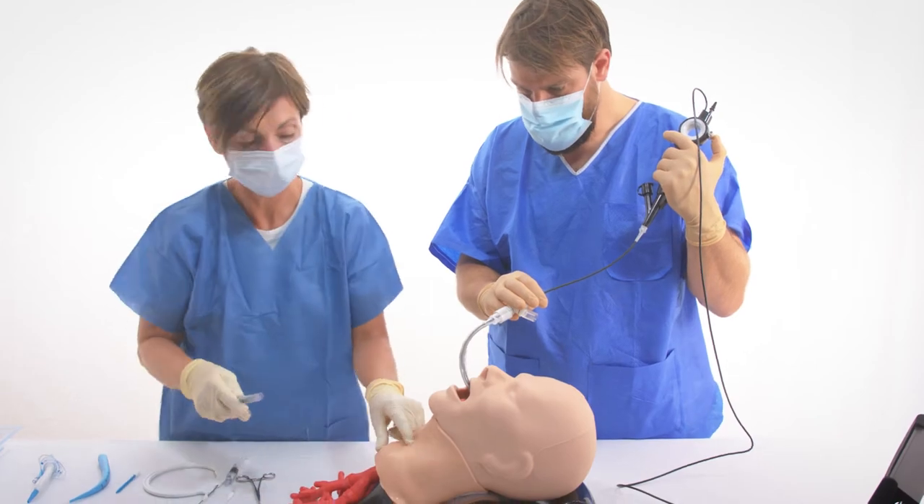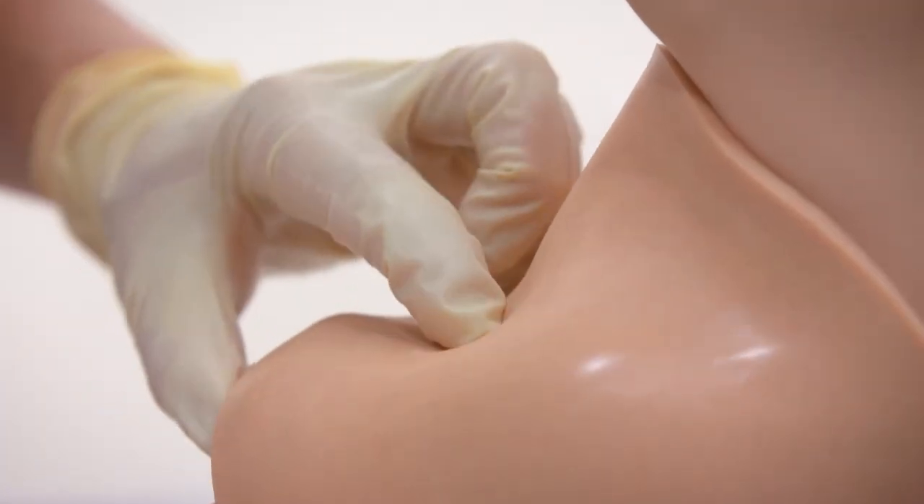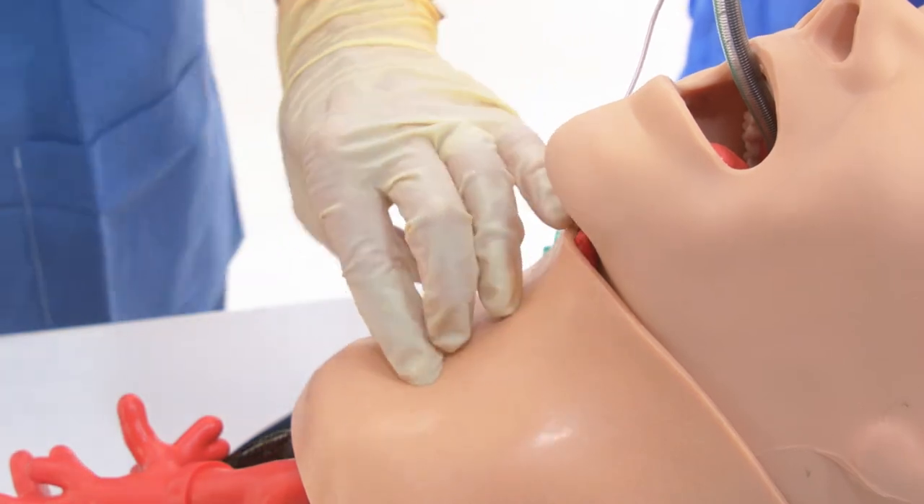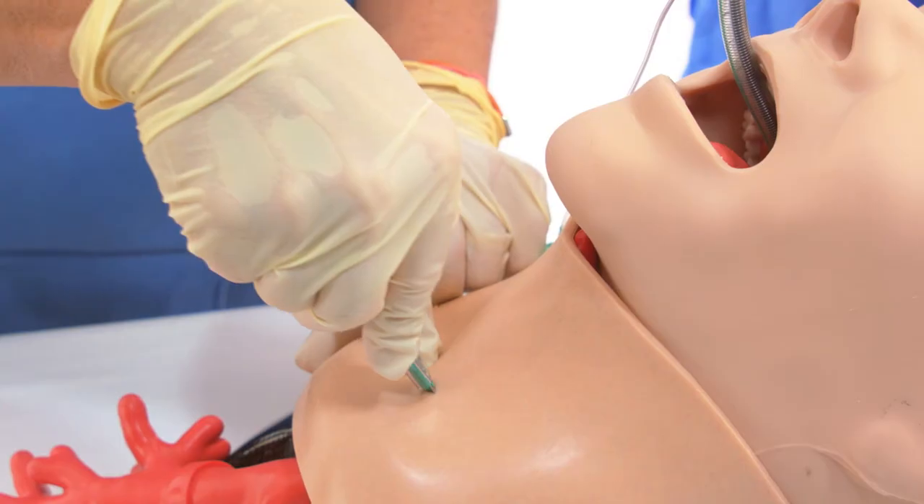Landmarks are palpated to ascertain proper location for tracheostomy tube placement, and local anesthesia is introduced before a skin incision is made at the chosen site.